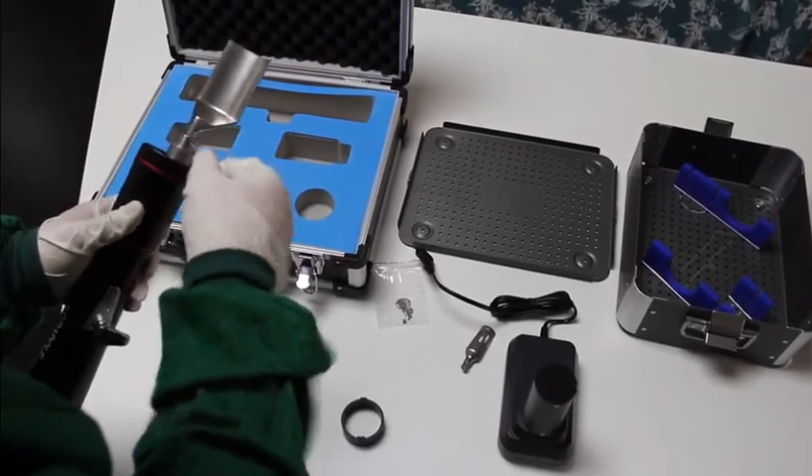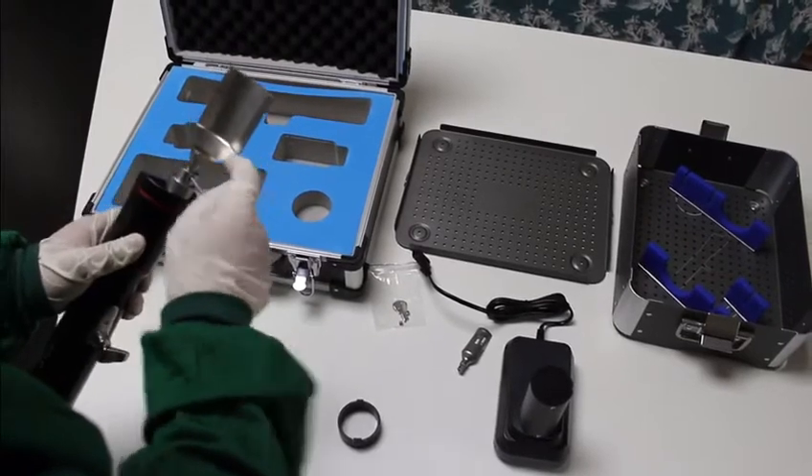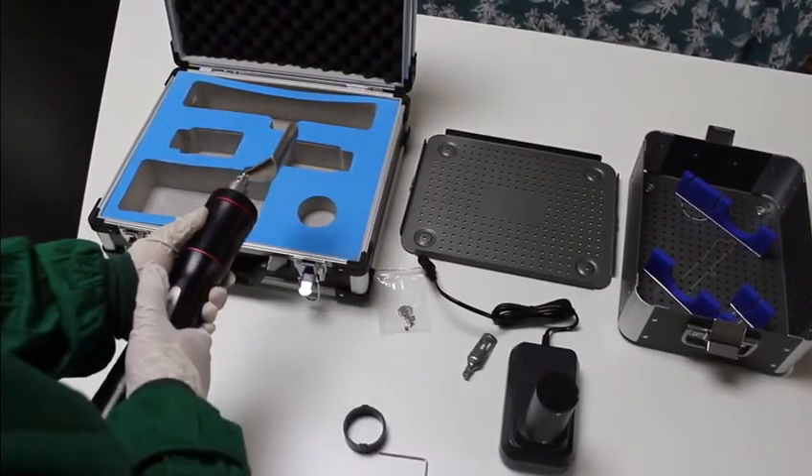Prior to using the saw, you may control the sawing speed by the switch and lock it after starting.